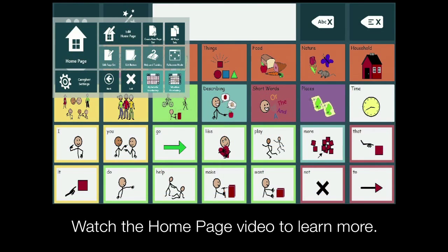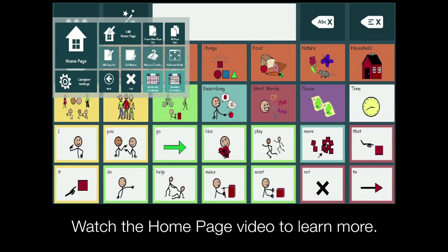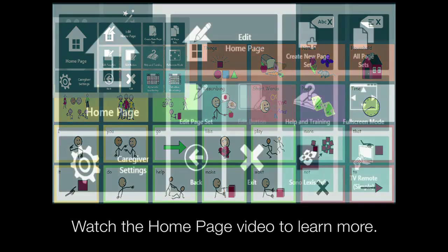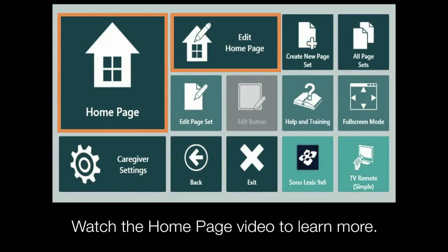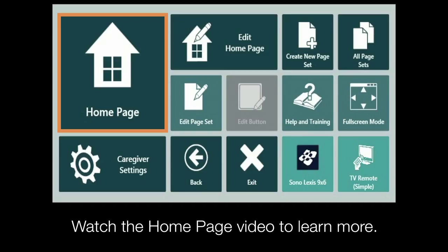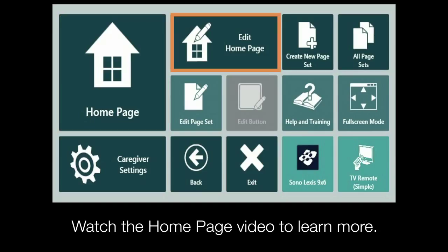Now that you know how to get to the Quick Menu, let me show you the tools. Let's start with these two buttons related to your home page. This button always takes you back to your home page and this one lets you edit your home page. You can learn more about these buttons and what they do in our home page video.